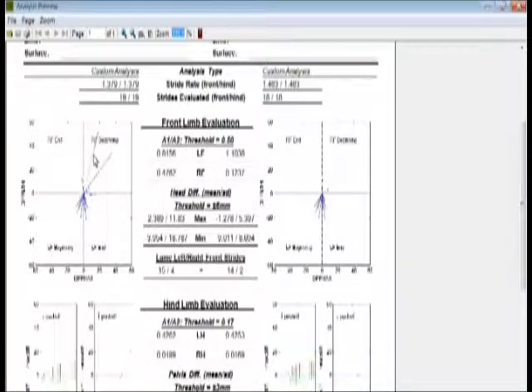But the min diff head is only about -4 millimeters, with a large standard deviation of about 18.8 millimeters. The small mean below the threshold of -6 millimeters and the large standard deviation make it difficult to conclude that the horse truly has a mild left forelimb lameness.